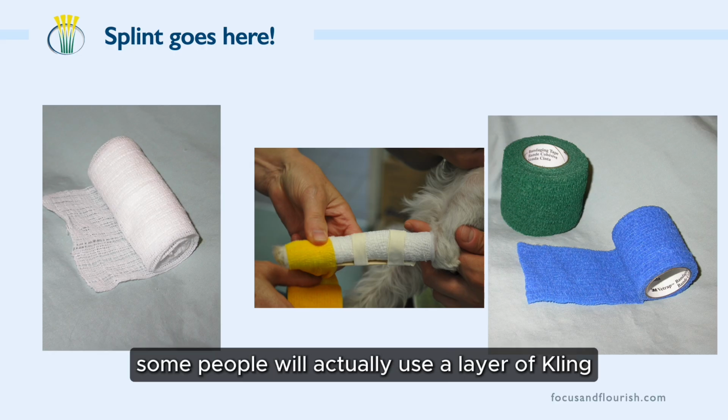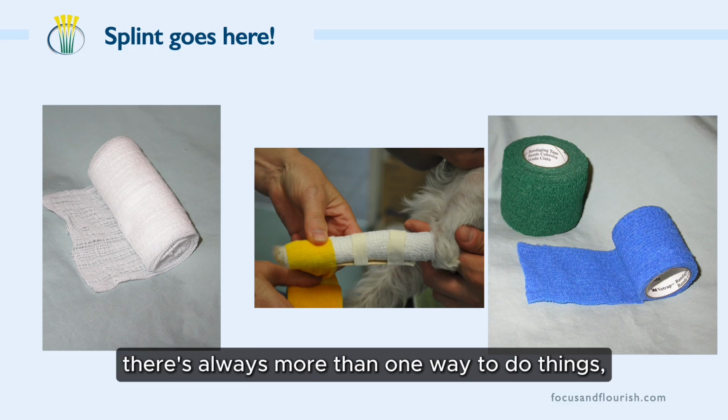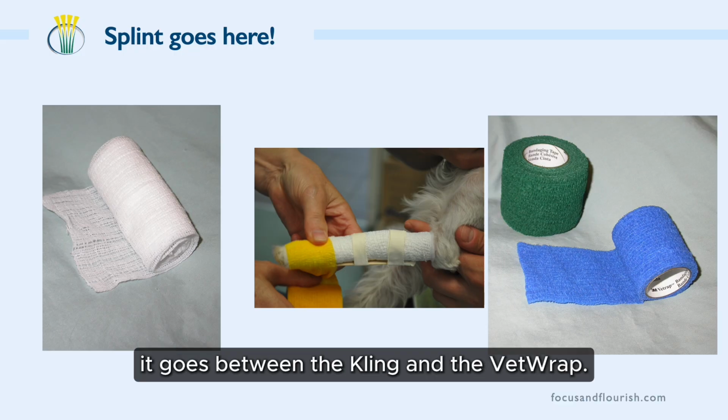Some people will actually use a layer of cling to support it in place. There's always more than one way to do things. But this is where the splint goes. It goes between the cling and the Vetrap.